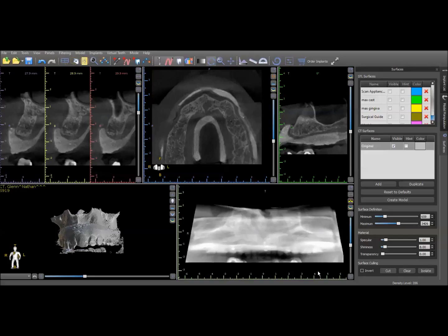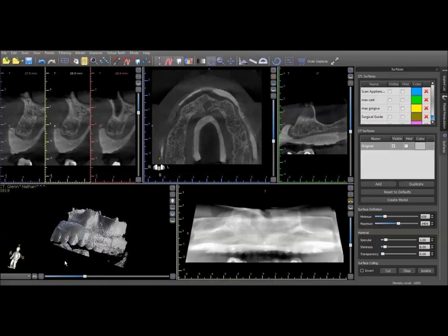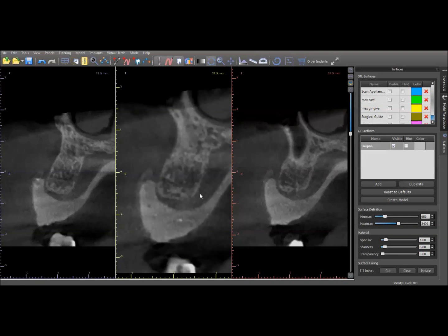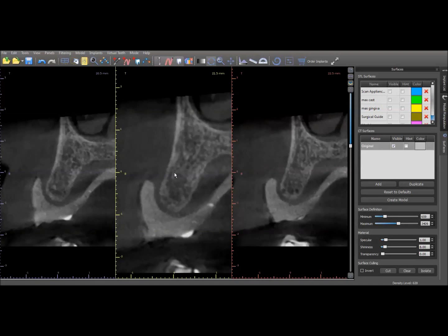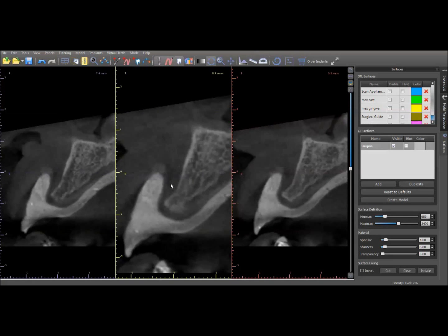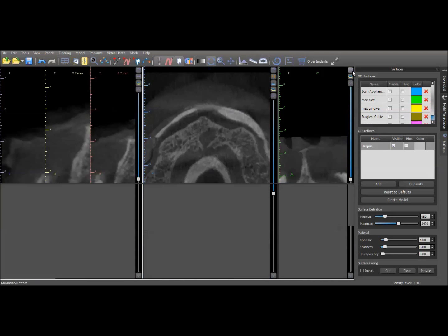Here's the actual case we're going to be planning. The first thing I want you to notice is that in the 3D view you can see that the radiographic denture shows up very nicely. If you come up here and look in the cross-sectional window, you can see that the tooth positions show up very nicely. As you scroll through you see the radiographic markers right there — this shows up very densely and makes it very easy to plan your implant positions.